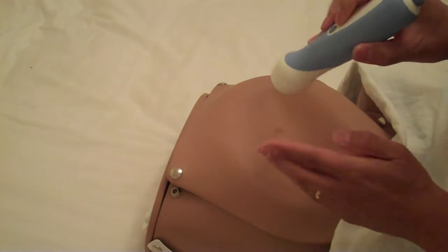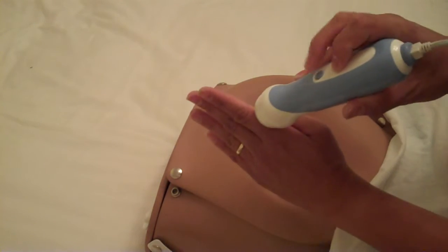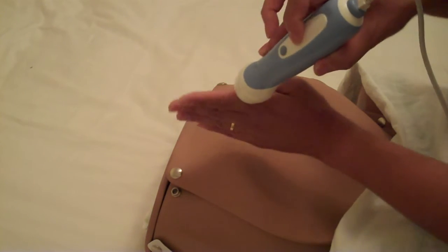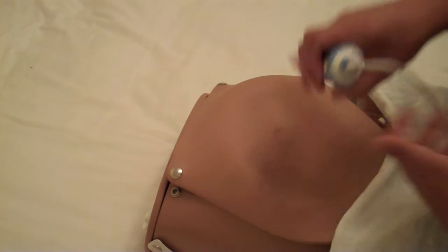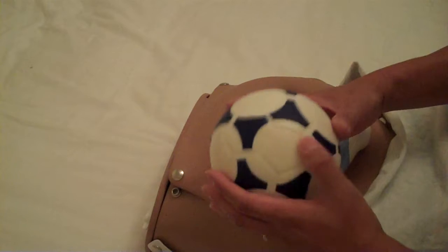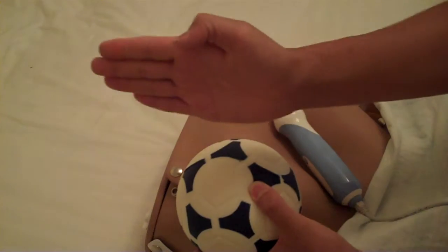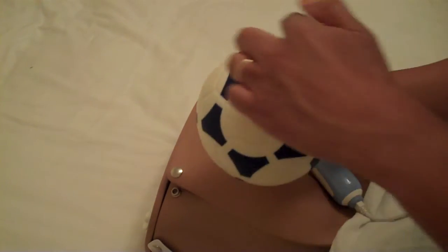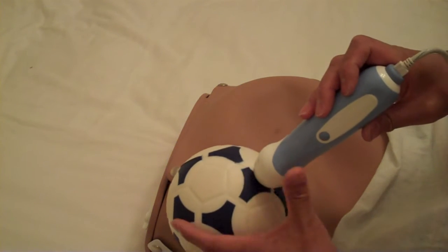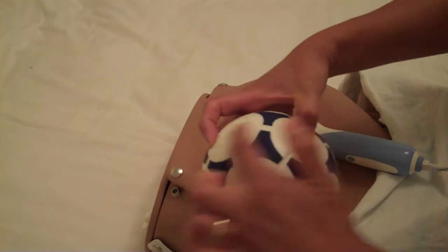Let's look at why. Now remember, this just takes a snapshot of, imagine a knife that comes out of the ultrasound. Just take a snapshot like that. This snapshot is completely different from this snapshot. Let's take this soccer ball, right? This is a sphere. If I scan like this with a dot pointing up, I'm taking a cut like this. That's going to look like a circle. Now, if I turn it so the dot is pointing this way, I'm getting a cut like this. That is also a circle.